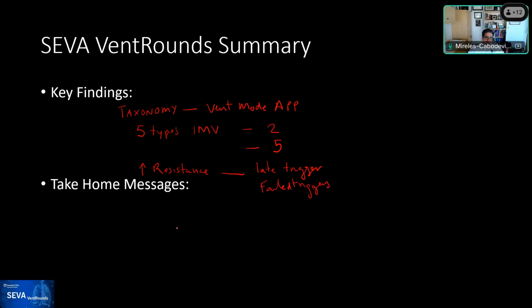And so the take-home message is, whatever ventilator you are working with, I would recommend that you go read it, try to see what's the taxonomy for each one of the modes that you're going to use more frequently, so you understand what the interactions are going to be with the patient.